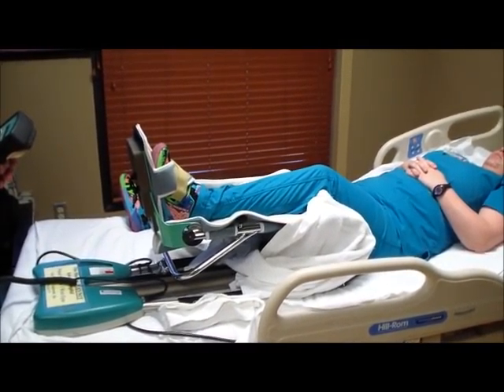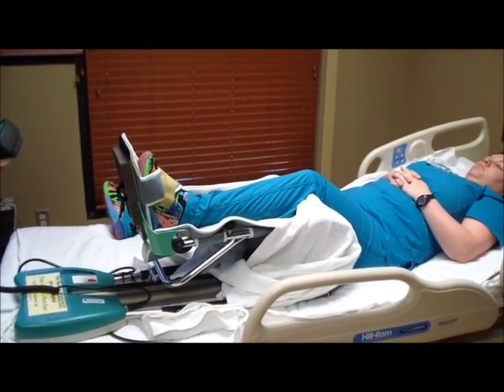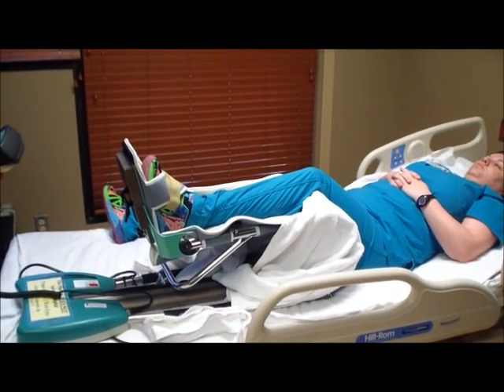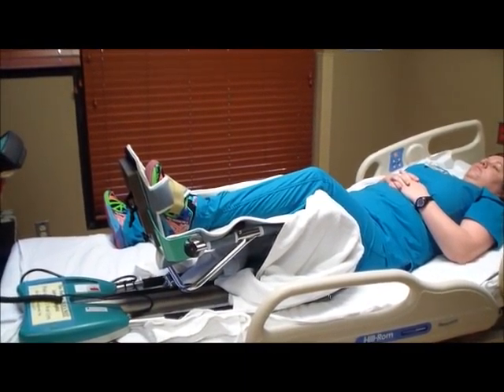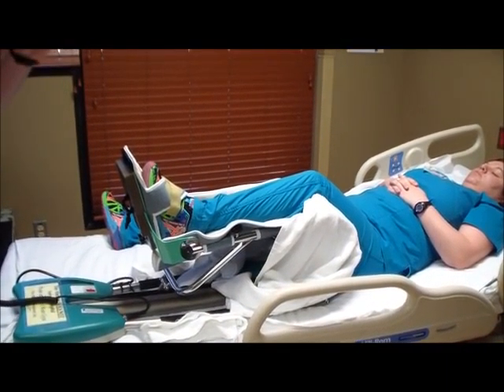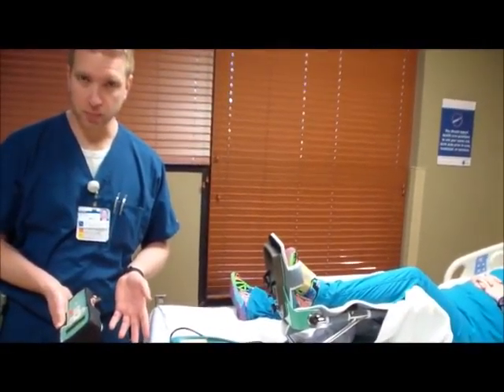So at 20 degrees right now. 30 degrees. 40 and 45. So if the patient's not having an adverse reaction to this, we have now placed the CPM properly.